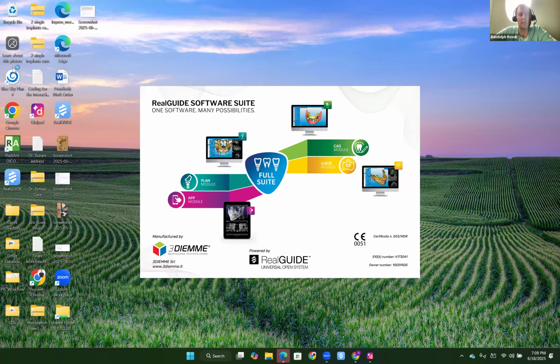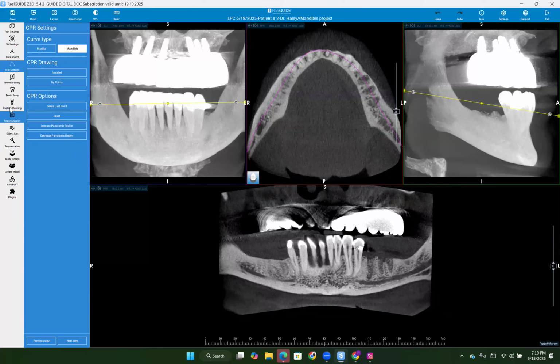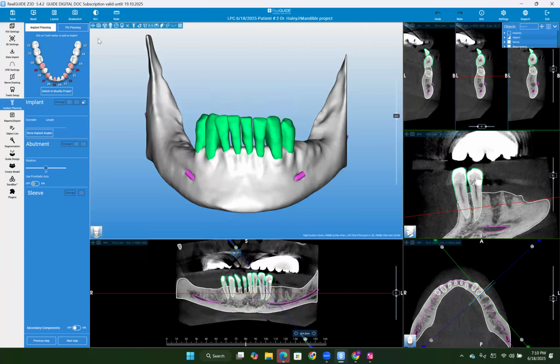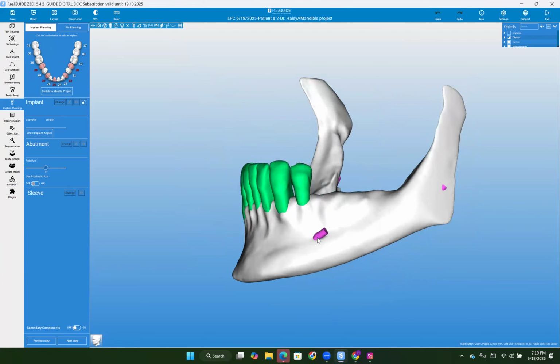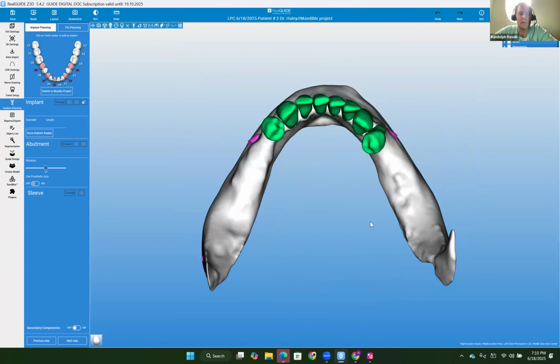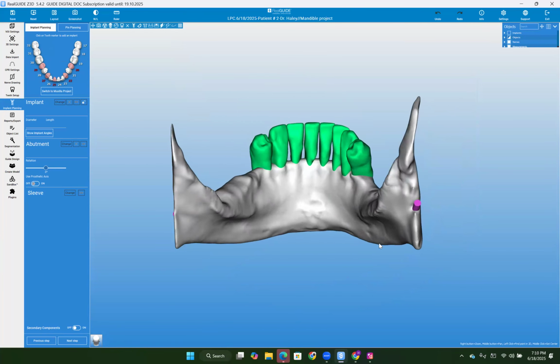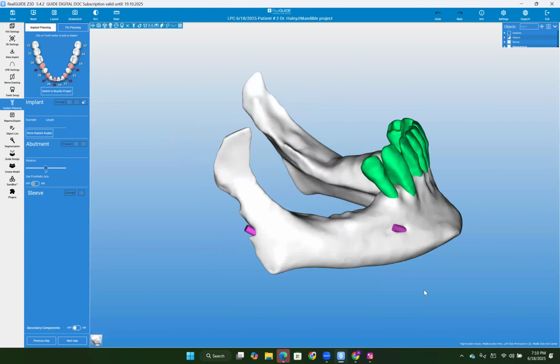Okay, so he had All-on-X done on the maxilla back in 2018. Correct. And now he has terminal dentition on the bottom and he's ready to go through the same process. Yes. 19 and 20 were extracted about 2 months ago, so those are still healing up and they were grafted. And on the maxilla, was the All-on-X immediately loaded or was it delayed? I am not sure, but usually how the doctor that placed it does it is he'll do an immediate load with PMMA, and then after healing, they'll switch it.